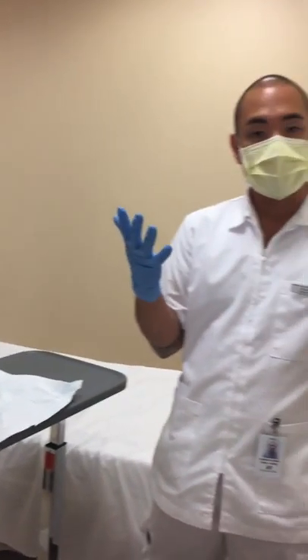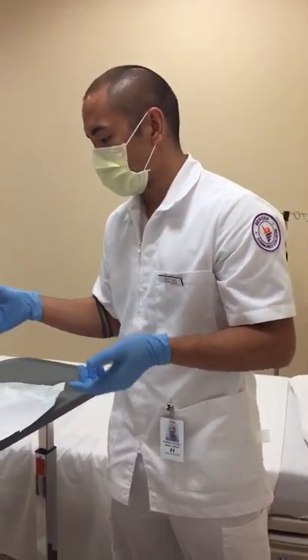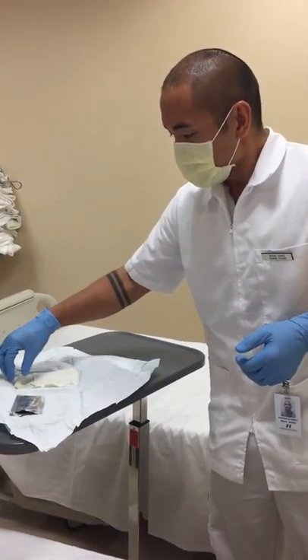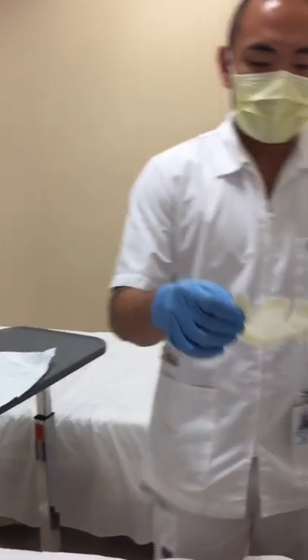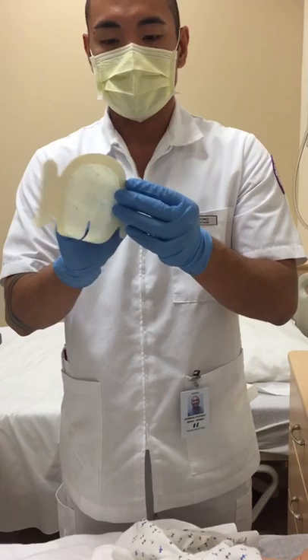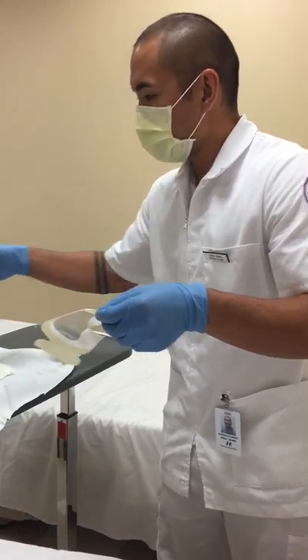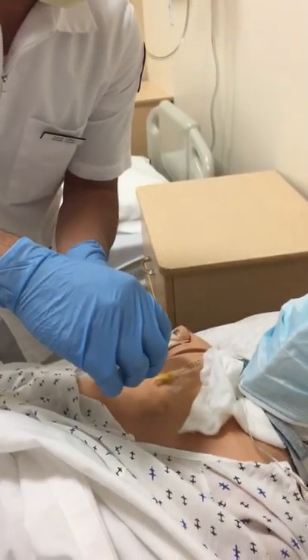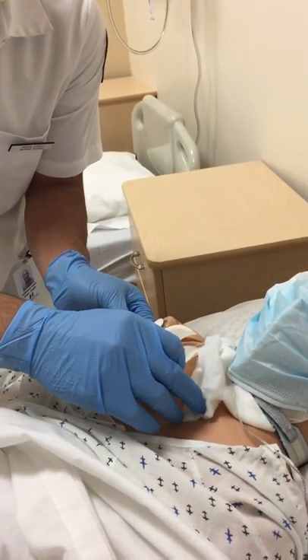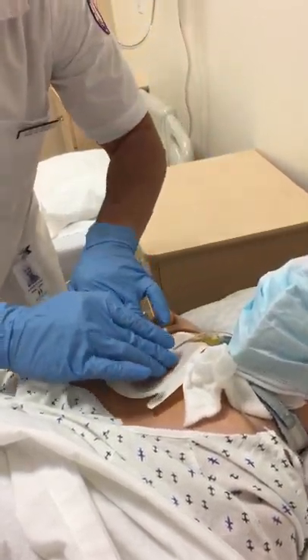I'm going to go ahead and remove these gloves. For video purposes I don't have another pair, but in reality I would then put on new sterile gloves because I'm going to apply the dressing now. Also make sure you're checking on your patient every so often. Doing okay Mr. Alvarez? He says he's okay. So now this is the dressing — I'm going to go ahead and remove this and place it over the site, making sure the insertion site is in the clear section and pressing out any air bubbles.